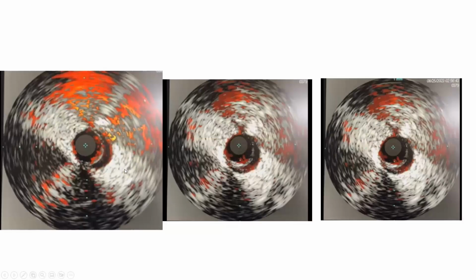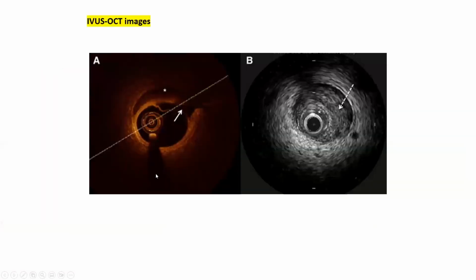And I want to show you, Wasawat shared with me, those are excellent IVUS pictures. So you see, this is your IVUS catheter here. They are in the true lumen. And you see that here, dark banana shape. Dark banana shape. That is how SCAD looks like. That's how a subintimal plane looks like. Dark crescent shape or banana shape.